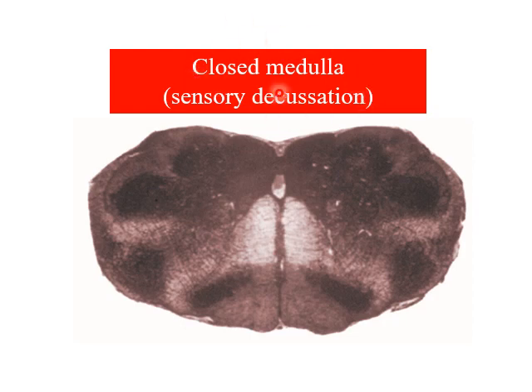Okay. Closed medulla, how do I know it's closed, as we said, here the central canal. Here the central canal becomes more posterior. The gracile and cuneate are bigger than those of the previous section. And here I can see the pyramids. And I can see the olivary nucleus.